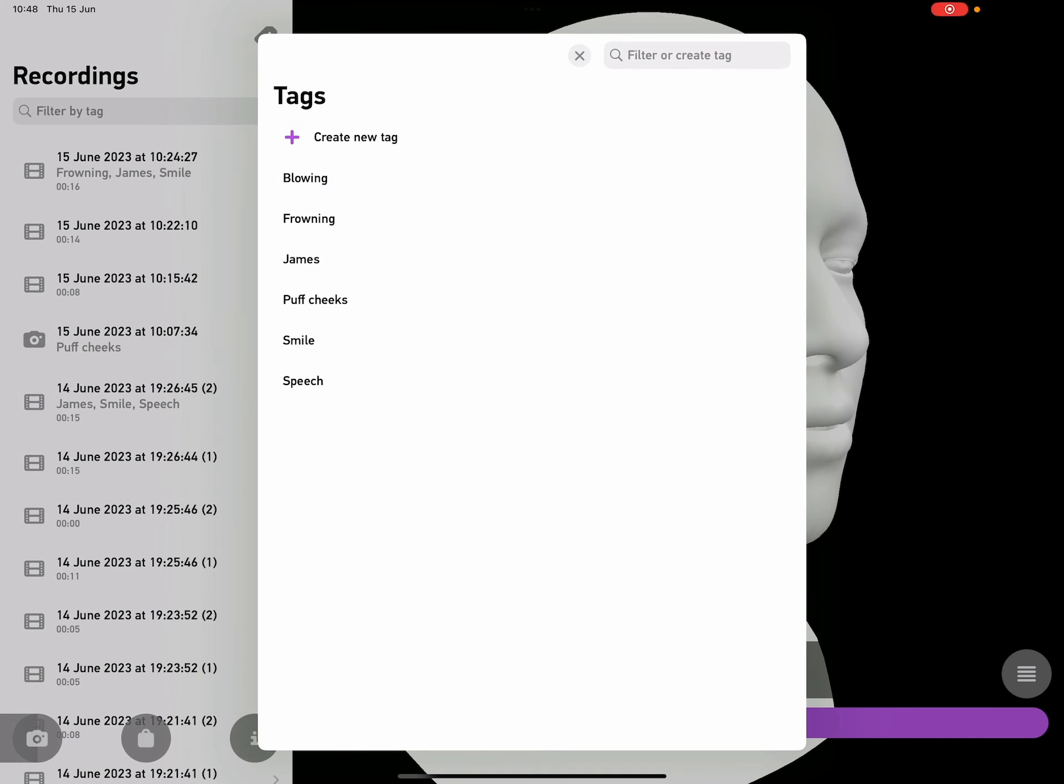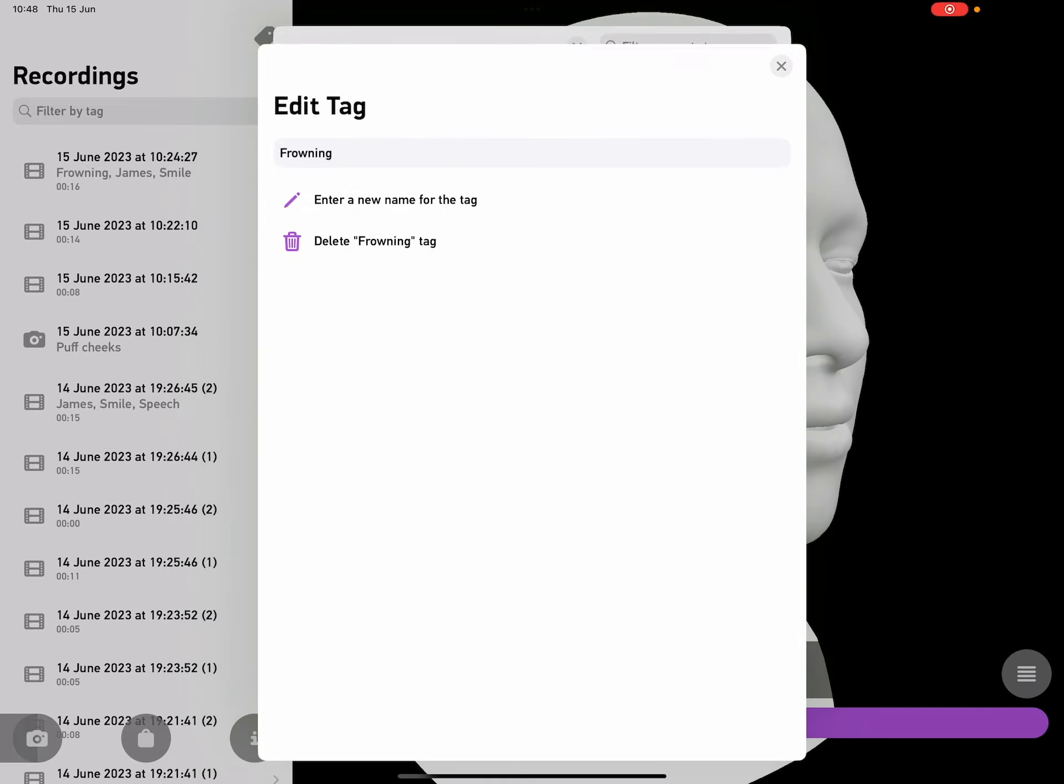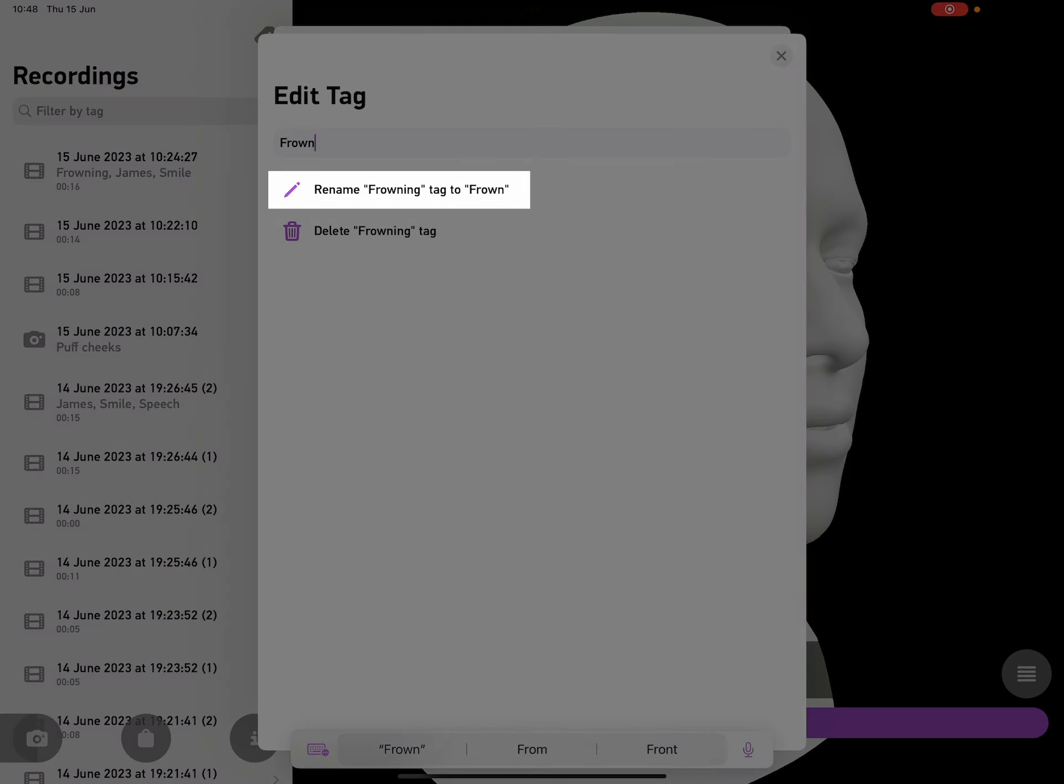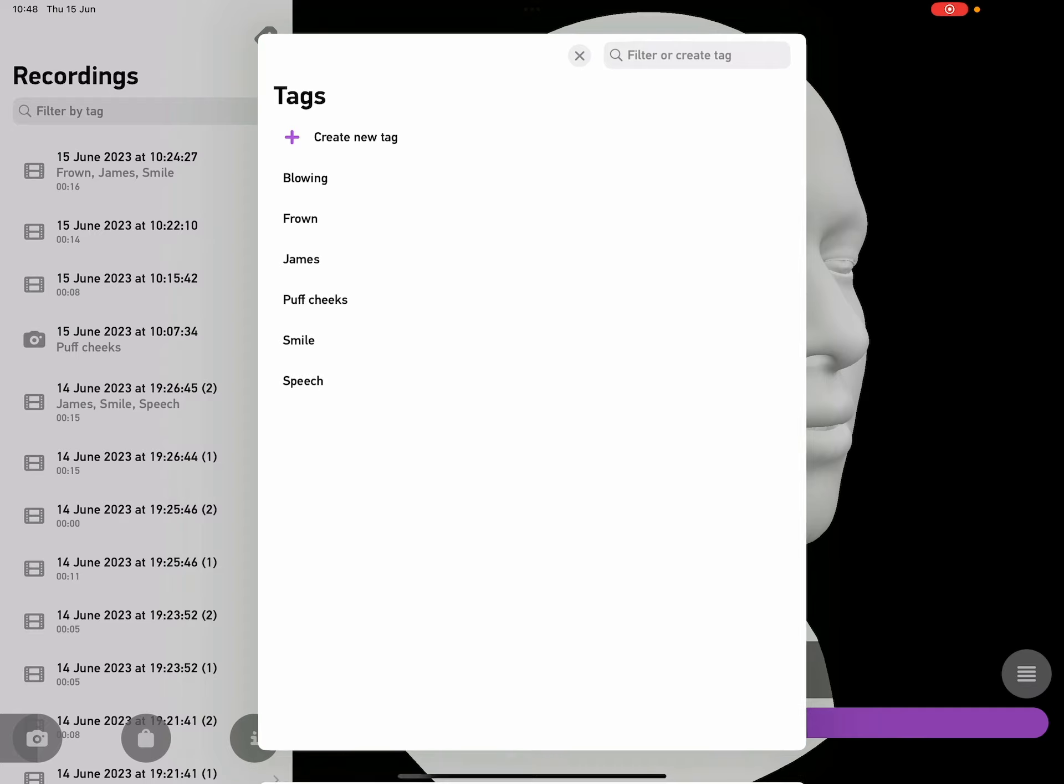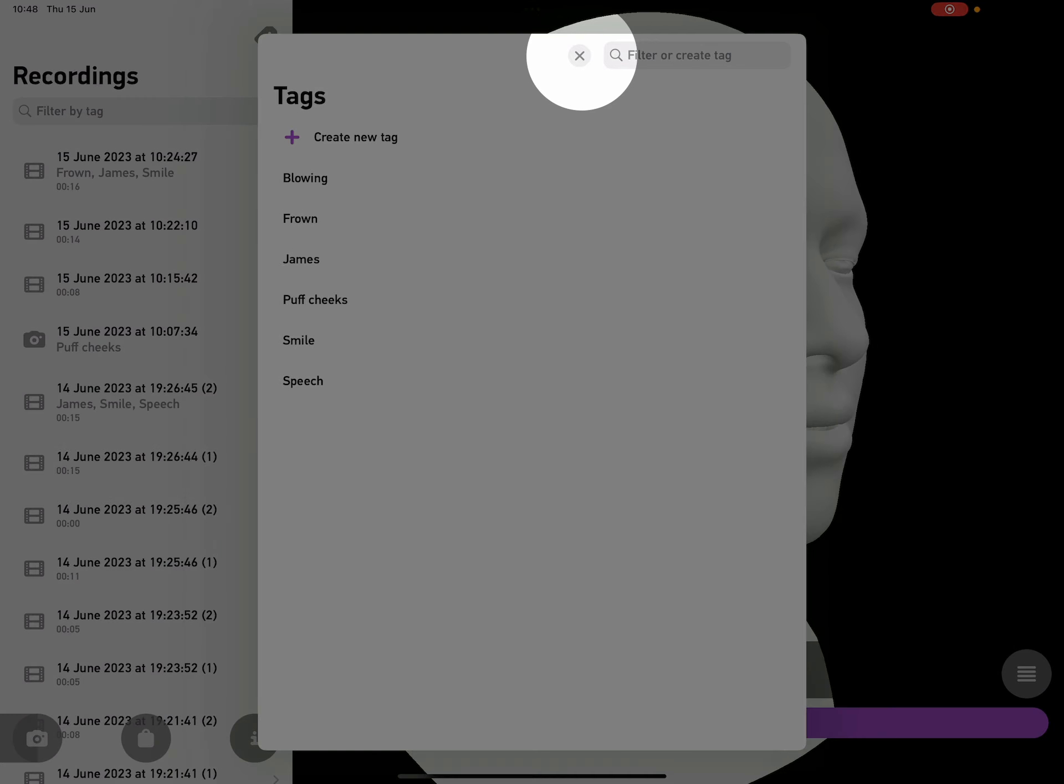Or I can tap an existing tag to rename it. For example, I could tap on frowning, and then just rename it to frown. And then tap on close to get rid of that screen.